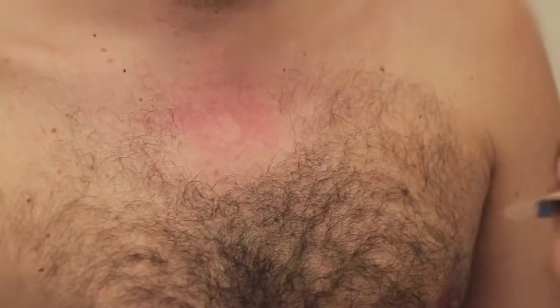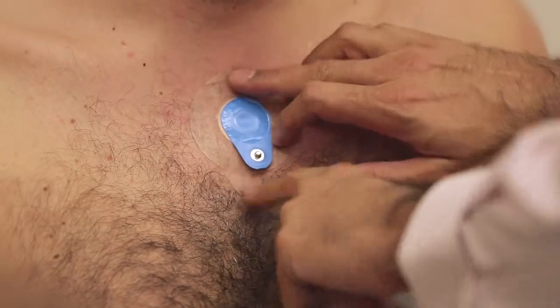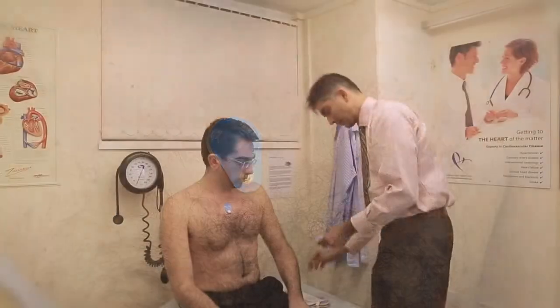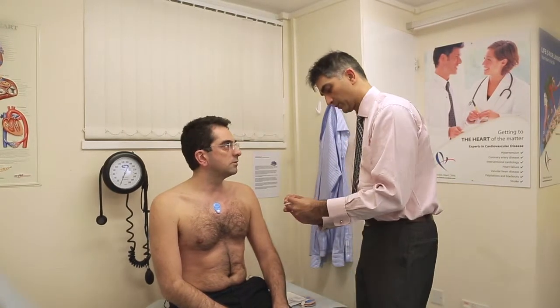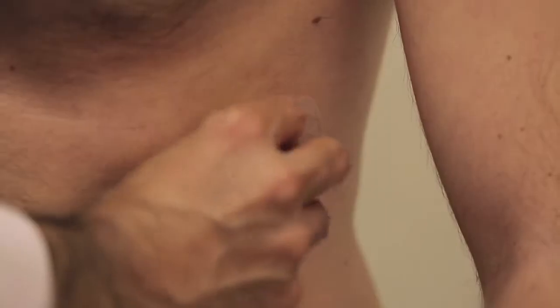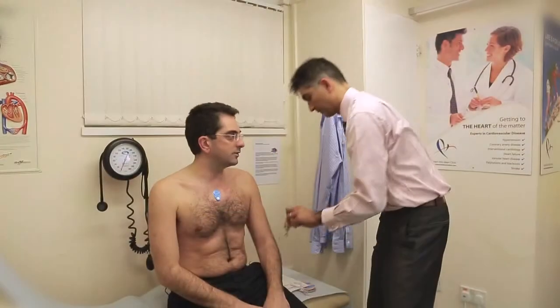Most patient symptoms occur intermittently and doing an ECG in the clinic room might not always capture the problem. With an ambulatory ECG monitor we're looking to see what the rhythm of the heart is and how it varies over the space of the 24-hour or 48-hour period that the patient's wearing the monitor.